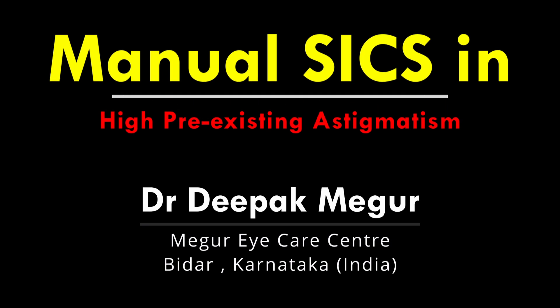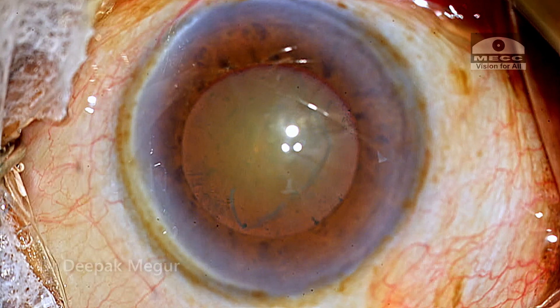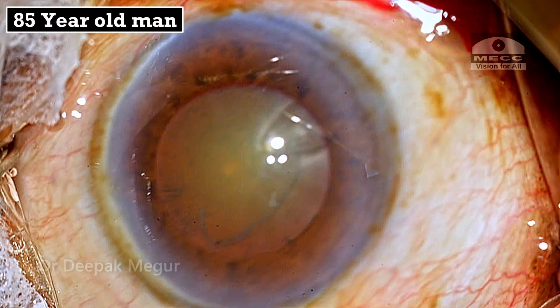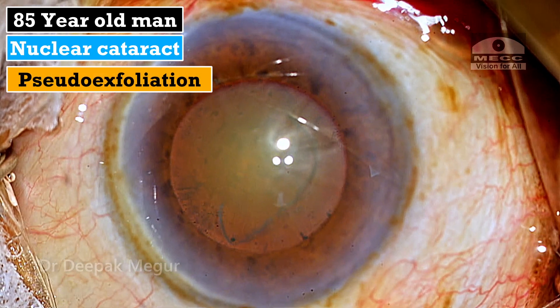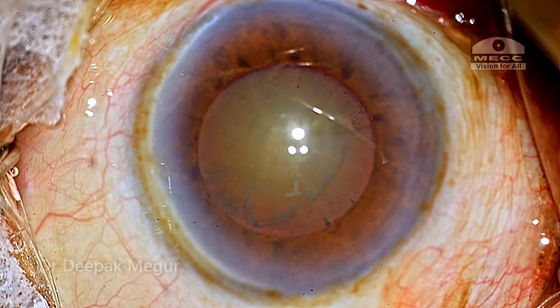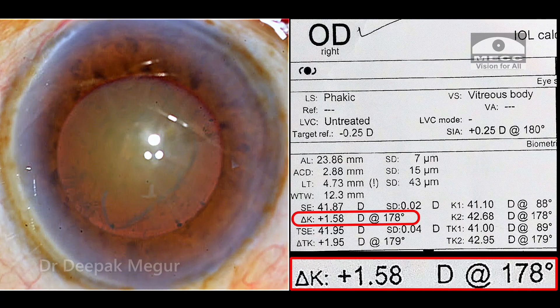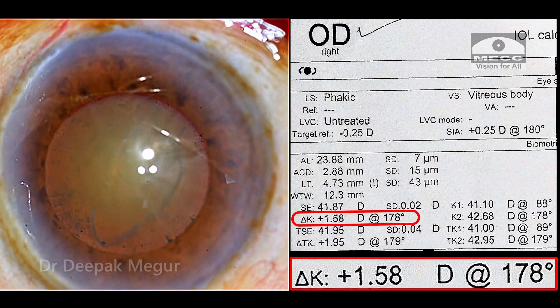Using manual SICS as a tool to correct pre-existing astigmatism during cataract surgery. This is an 85-year-old gentleman with nuclear cataract and pseudo-exfoliation who is posted for cataract surgery. He has a significant amount of against-the-rule astigmatism.